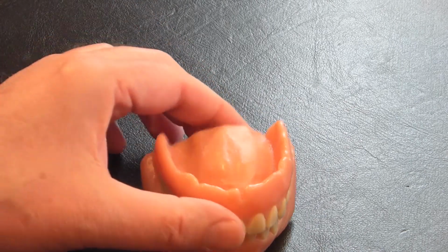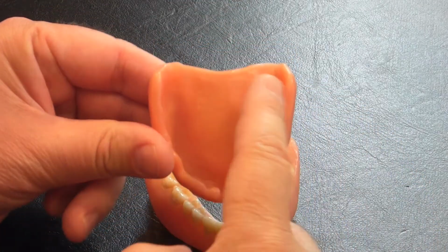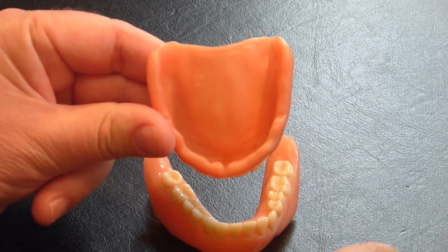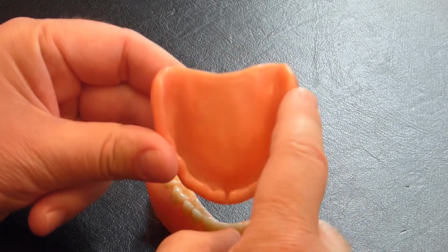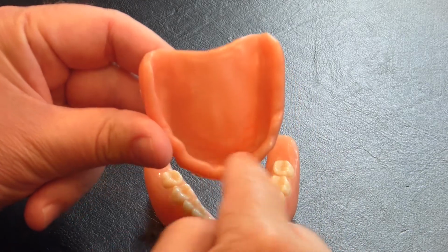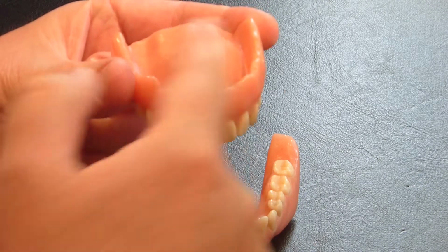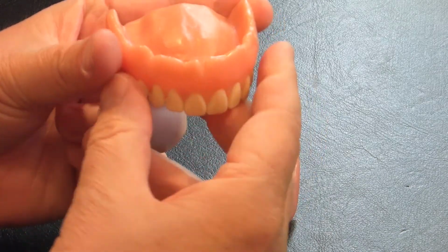How do dentures stay in? So the upper denture, because of how it's shaped, functions kind of like a suction cup. You get a nice seal all the way around. You put it in, press up, squeezes the air out, and it should stick.